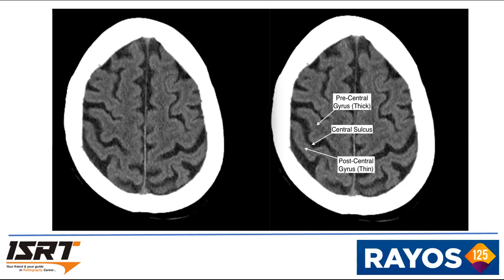So, what is the importance of the precentral gyrus and postcentral gyrus? The precentral gyrus houses the motor area, and the postcentral gyrus houses the sensory area. So any abnormality to this area causes motor or sensory impairment to the patient. So if you miss the slice, you're simply missing the diagnosis. So be very apt in keeping these things in mind while you are filming.